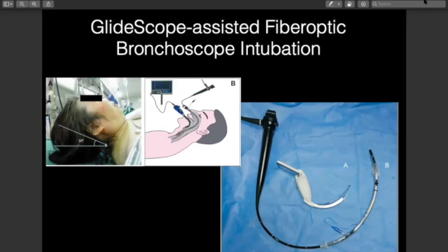You know, even with the very obese patients, if we take a bariatric patient, it's usually pretty reasonable to get the tube in. With our Glidescopes and our McGraths, optimal positioning, ramping, 2 practitioners at the head of the bed, straps, airways, we're usually able to mask, we're usually able to intubate. But I'm willing to say that in the very obese patient, more poor outcomes occur on extubation than intubation, because the obstructive sleep apnea is so severe that when you extubate, the residual anesthetics lead to inappropriate reaction to carbon dioxide as well as decreased pharyngeal tone, and they fail frequently.